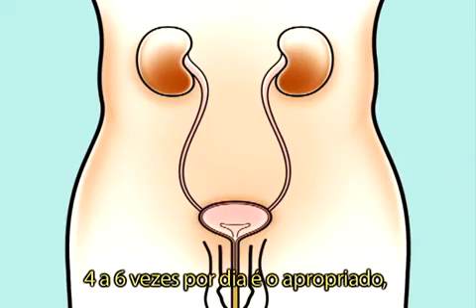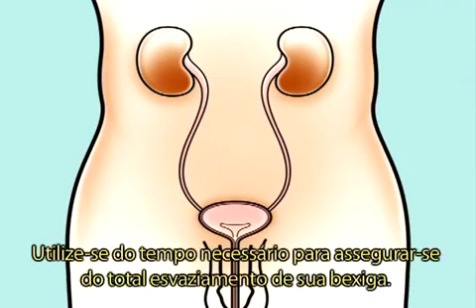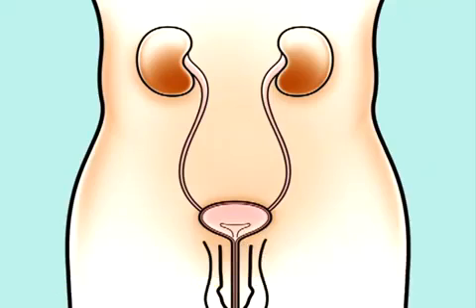4 to 6 times a day is appropriate, depending on your fluid intake, diet, and medication. Take your time to ensure that the bladder is emptied completely each time, as urine left over in the bladder might cause infection of the urinary tract.